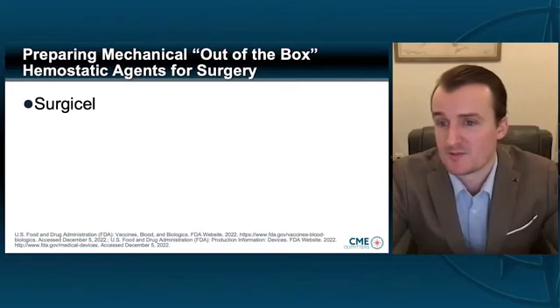Now, ultimately, how many times have you tried to open a product and have that product be expired, but because you've checked it, it hasn't impacted the patient? I actually have been very lucky to not ever have seen an expired product, but maybe something pretty close to expiration date, but always within. So I think that boils down to HSS's quality checks. I think that's important, right? We're checking these products on the back end. So that doesn't just mean the team in the OR, it means the team that's stocking everything as well. Now, some specific examples of prepping hemostatic agents for surgery.